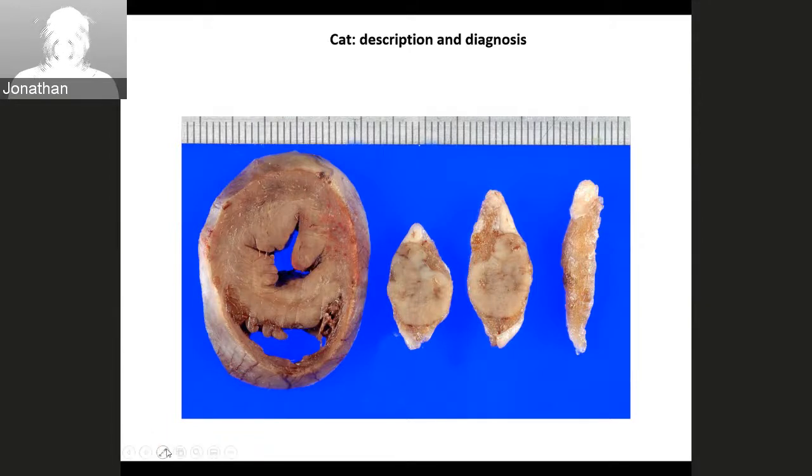I think there is nothing else that I can see. I think these pinpoint reddish lesions are probably artifactual. Ah, that's an artifact. Sure. And also on the right, you've got this little red dot. A little bit above on the free wall.